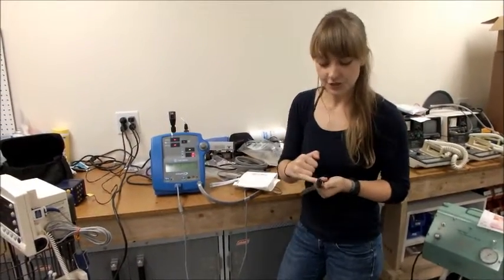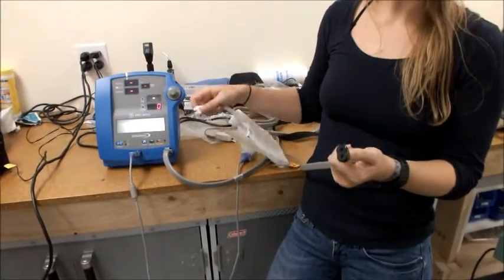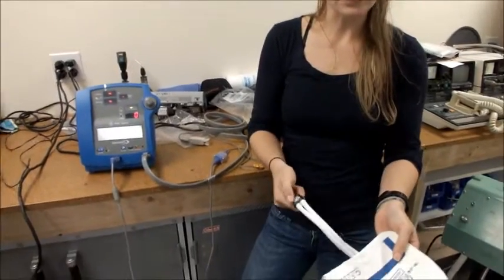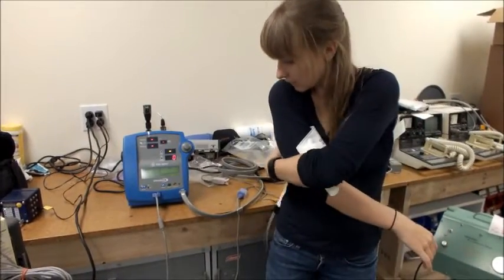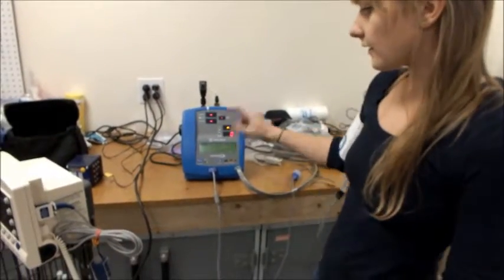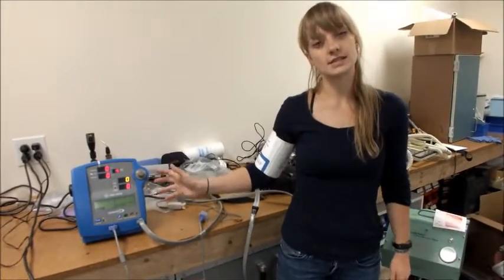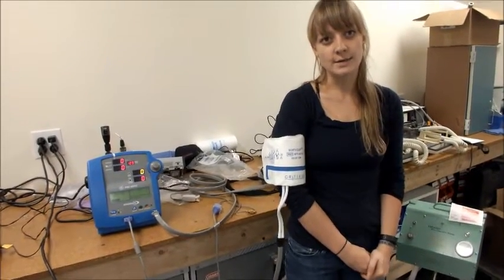Sometimes you'll get a cord that'll have two connections on the other end of the blood pressure cuff. If that's the case, you're going to have to find a cuff that connects directly to the cord and test blood pressure on yourself, since we don't have any adapters for the SimCube that'll work for double tubing. To test it on yourself, open the cuff, wrap it around your arm, make sure it's velcroed in place, and then hit vitals or start on the machine. Once you do that, you should hear the machine start to run and the cuff inflate on your arm — it might be a little bit uncomfortable, but that's totally normal.